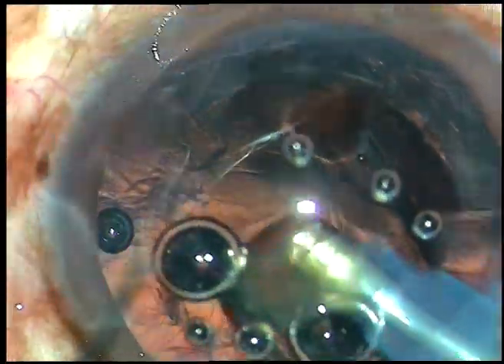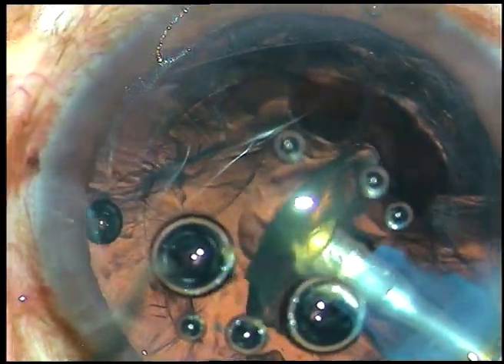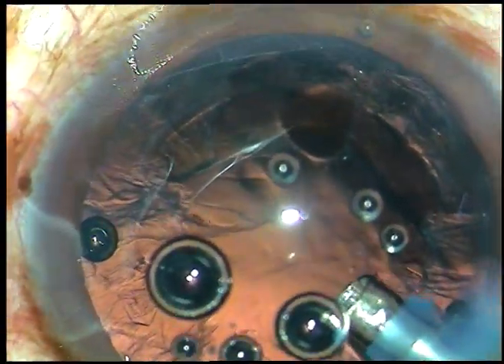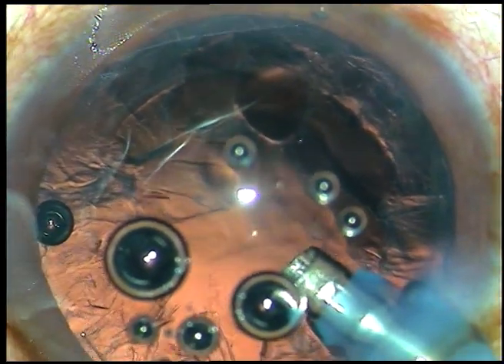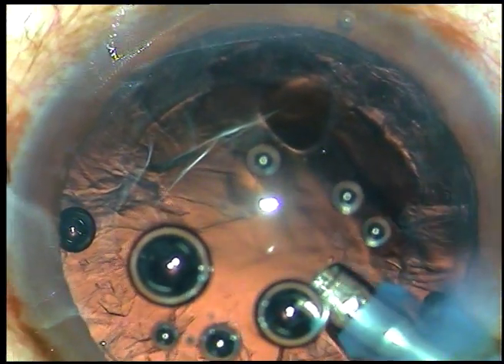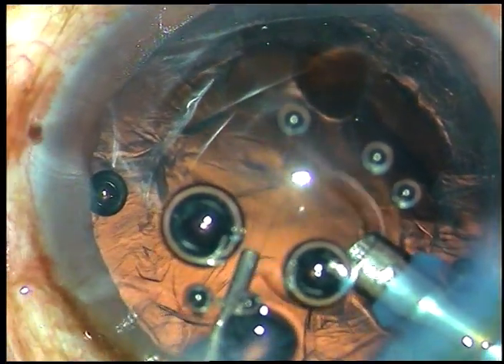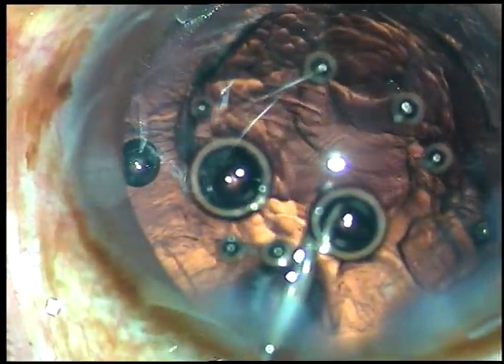The nuclear fragments have been emulsified. Again I inject viscoat and then come out.